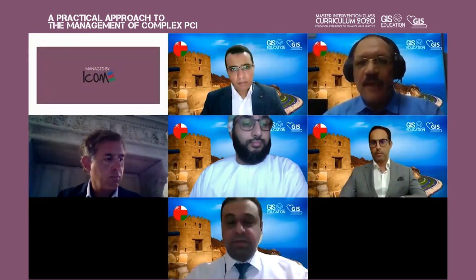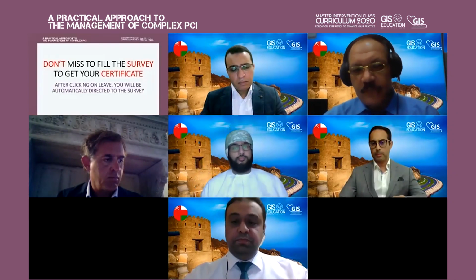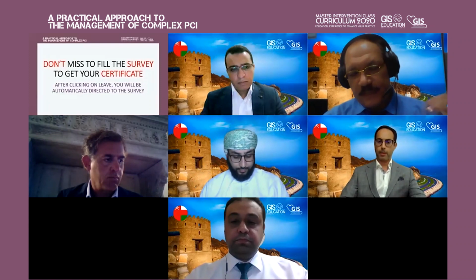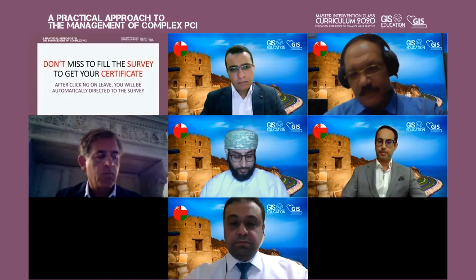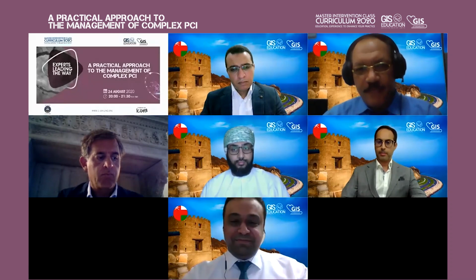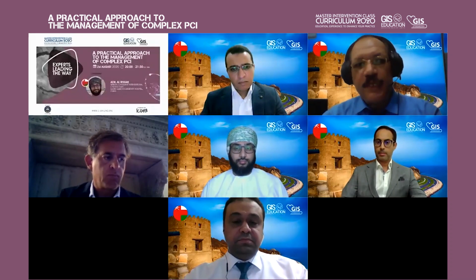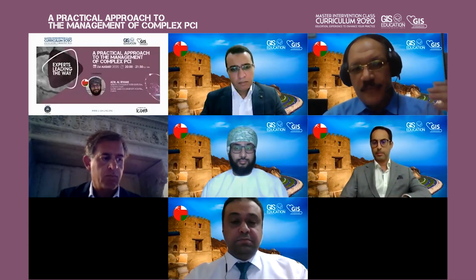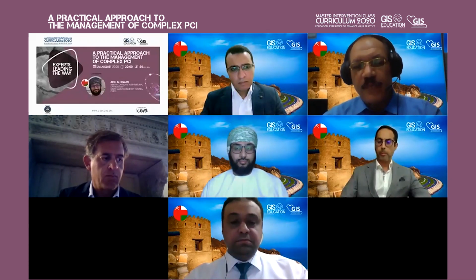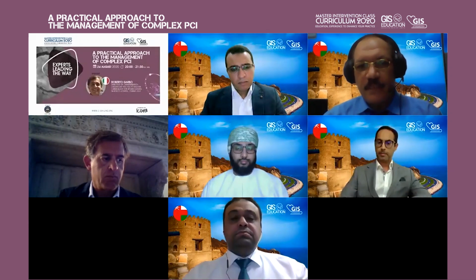Okay, so if we can go to this tight lesion, if we can detect it either by this poor blind technique, primitive, or I think better by IVUS, if we go there and see the lesion and see the thrombus and see the size of the SVG, we can, I think, get better results in these cases.